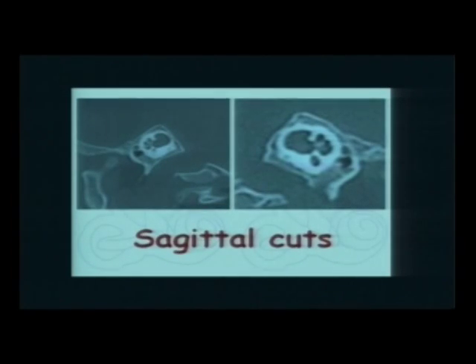Can you see here the facial nerve and its branch, the chorda tympani? Nice. It's very nice here. And this is the posterior canal, and this is the superior canal. Okay, this is a marvelous cut. Let's have a look here because there's something in the anatomy that's very irritating in the cochlea.